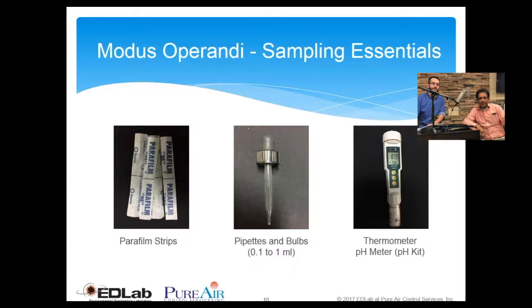So to measure these things, it is very important that we should also collect the pH of that water as well as temperature, because these two parameters are going to be supportive and helpful to ascertain that the other organisms or other situations which support the other microbial growth are not prevailing, because this microbial growth is going to be a great feeder to the Legionella.